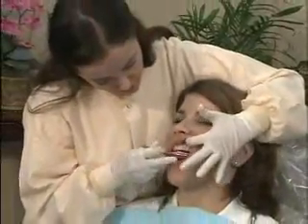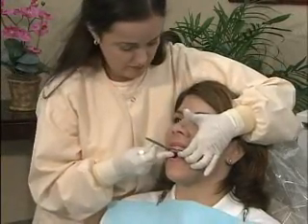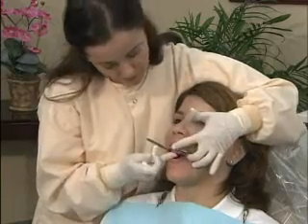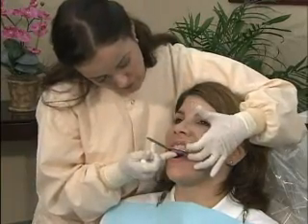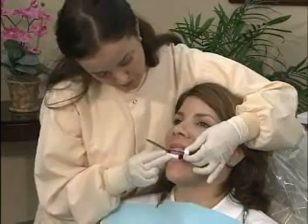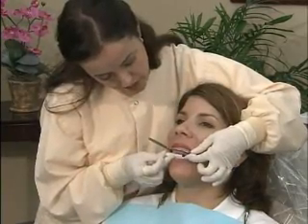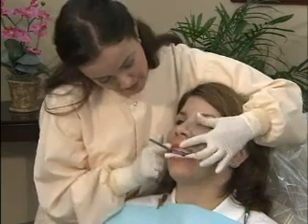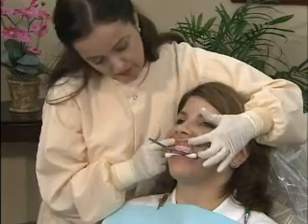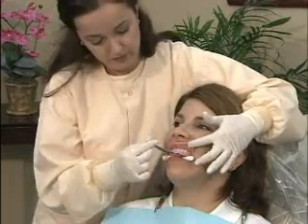Place the fork in the patient's mouth with the arm of the fork towards the patient's right. Make sure the arm is coming straight forward so that it will not interfere with the face bow joint piece in the next step. Be sure to get an adequate indentation of the upper teeth so that the stone models will orient correctly in the record. Support the fork intraorally with cotton rolls on the lower teeth, and make sure that the fork doesn't rock.